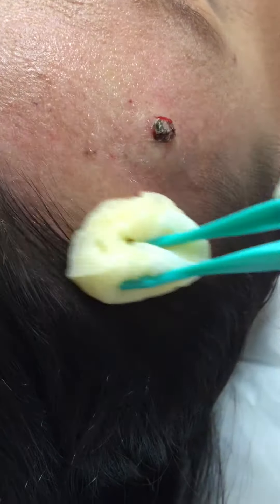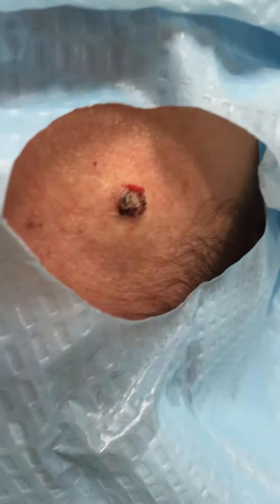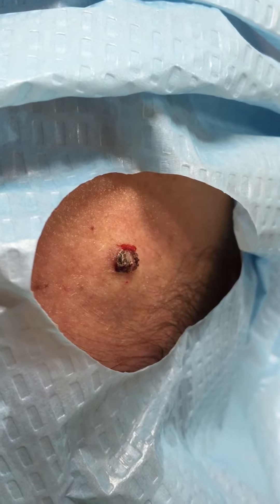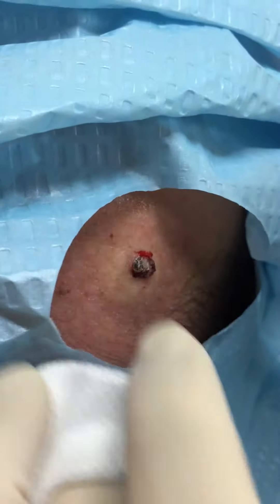Just a little drape over. I'm going to get a little small size specimen and send that away to the pathology.